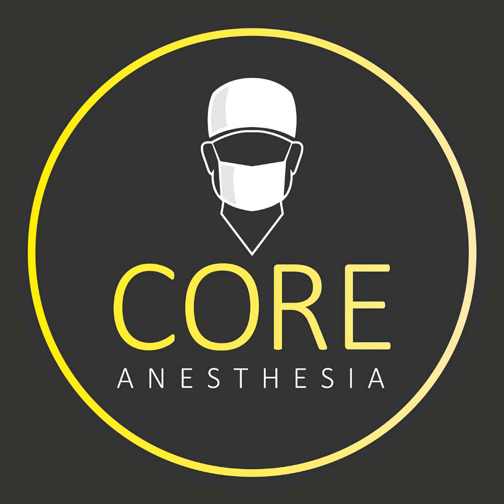So when you're starting to mask the patient, look at that end-tidal on your monitor and make sure you're getting end-tidal come up. If you're not, you need to do something different. We're not going to go in totally to the different ways to mask during this episode, but just know that if you are masking appropriately and you're still not getting end-tidal, the next steps would be to either put an oral or a nasal airway in the patient's mouth or nose. You can do 2 hands on the mask to get a good seal and have somebody else squeeze the bag for you, etc. But you really want to make sure you're able to ventilate that patient. So we're not just simply giving oxygen, but you want end-tidal coming back, meaning you're ventilating the patient.